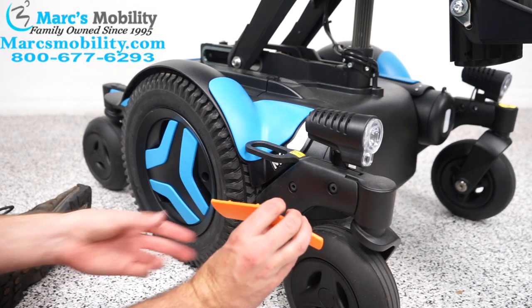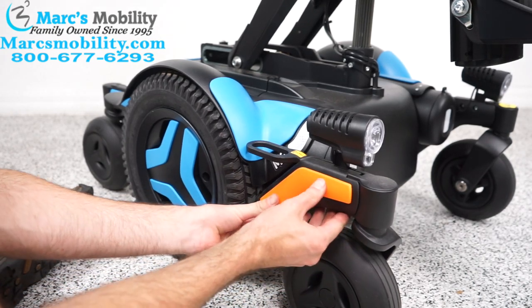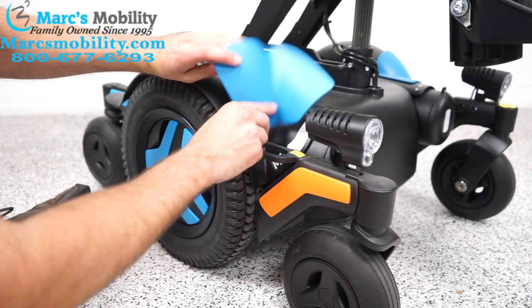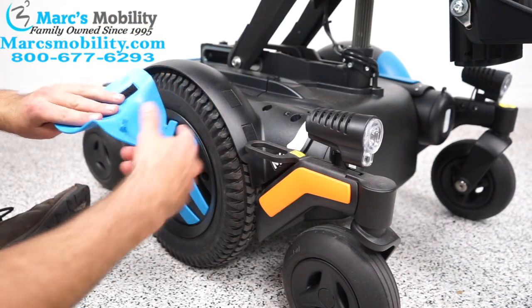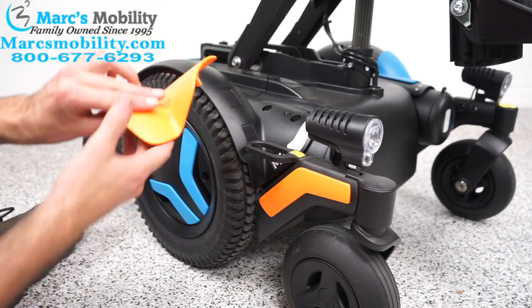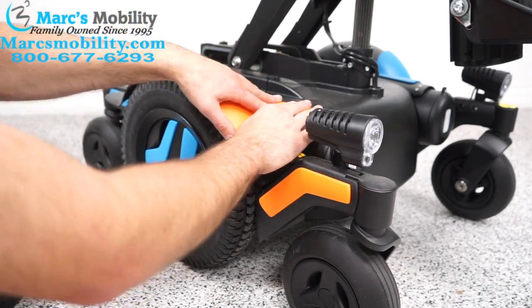To put the new one on, you would just line these up and just pop them in. Same thing with this one here — it's got some Velcro and it's got those two little holes that go here. So same thing with the orange one, I'm going to pop those two in, and then the Velcro should also hold it down.